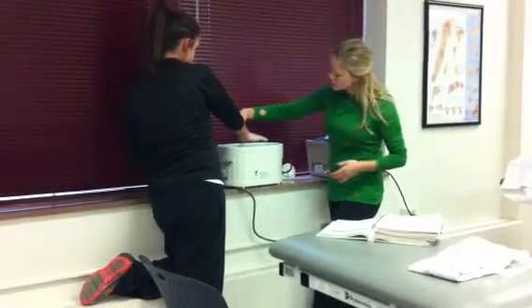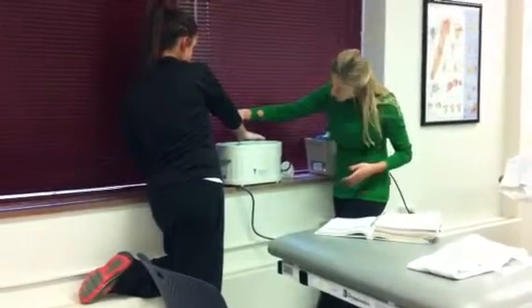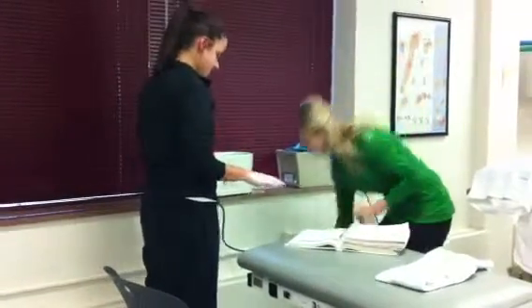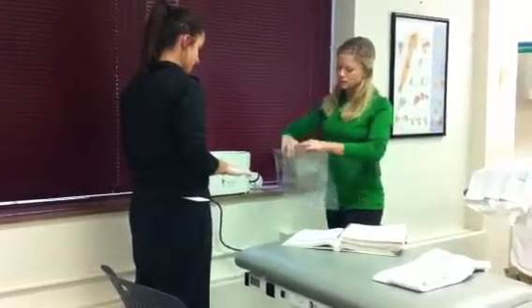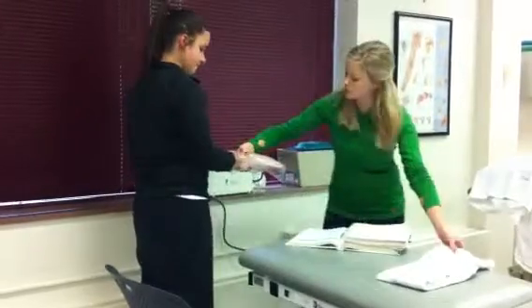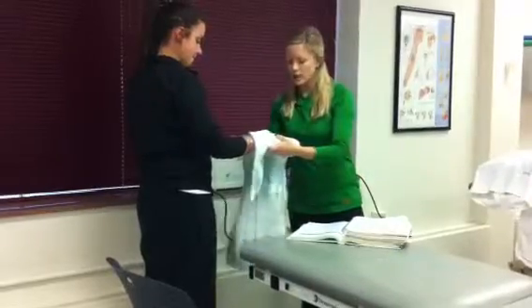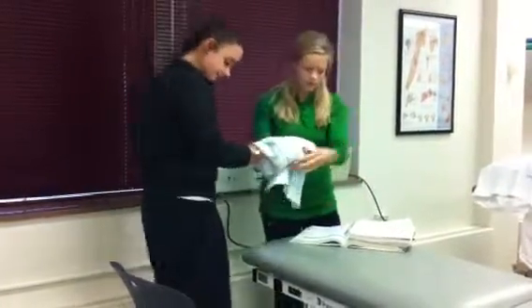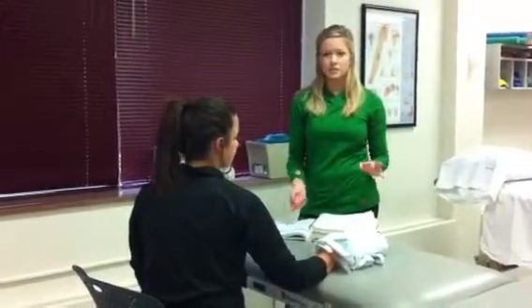After the last dip, you want to make sure that you let it dry. Then we're going to get a plastic bag — she'll put her hand inside. Wrap it up, and make sure that she doesn't move even when it's in the bag so that it doesn't break up. Then go ahead and wrap it in a towel. You just have the patient sit there for 15 to 20 minutes.